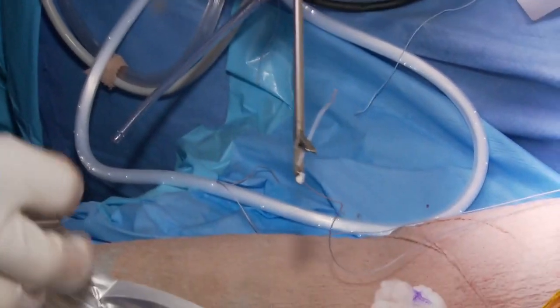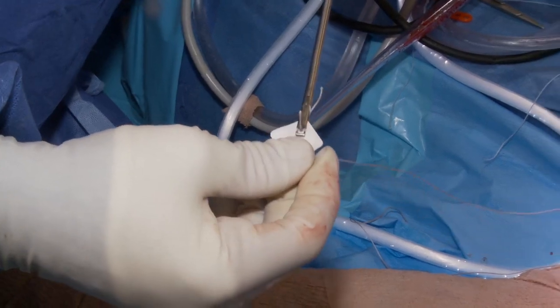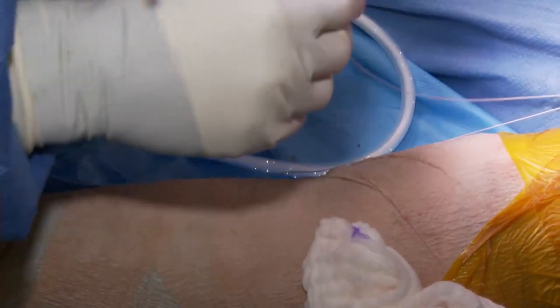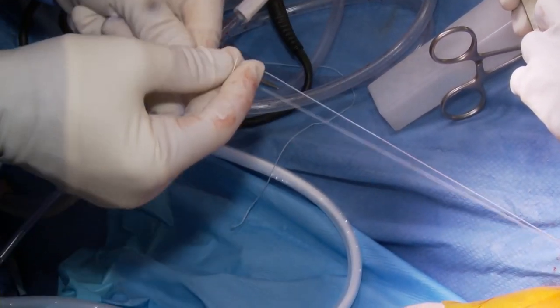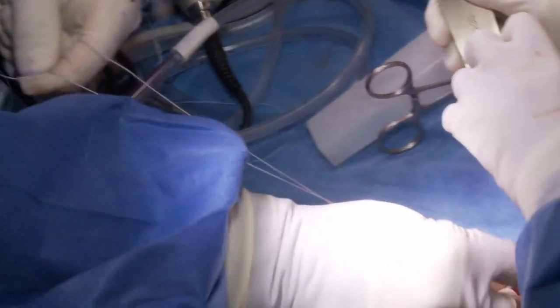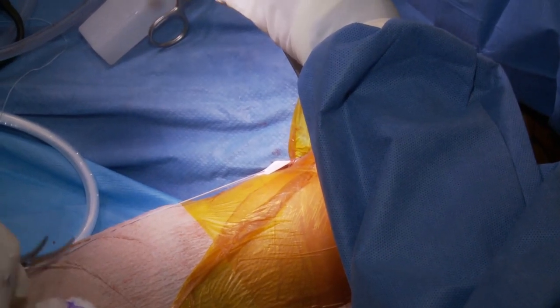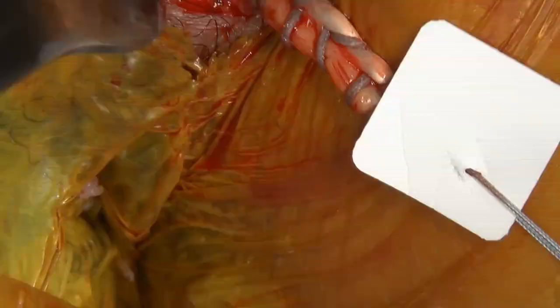Thank you. So we're gonna put another patch around the biceps tendon, again, just to help hold on to all the biological healing properties that will come out from the bone marrow around it. And we just put this kind of loosely. We'll pass it down with the biceps tendon once we get into the actual position that we need to be.